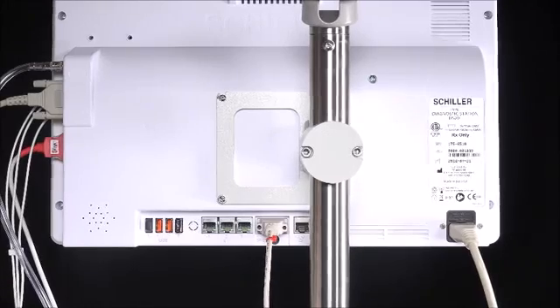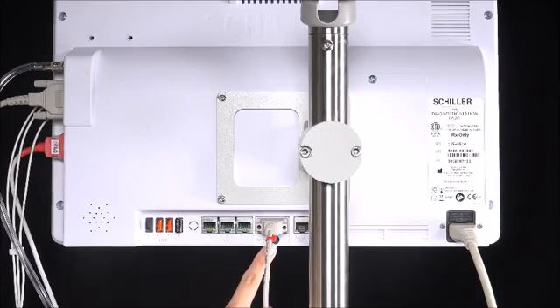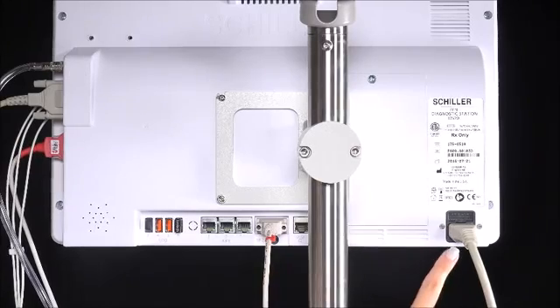On the back panel, there are 4 more USB ports, the serial in and out ports, the RS-232 port for the spirometry sensor, the Ethernet network connector, and the mains connector.